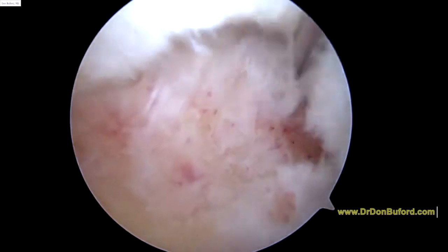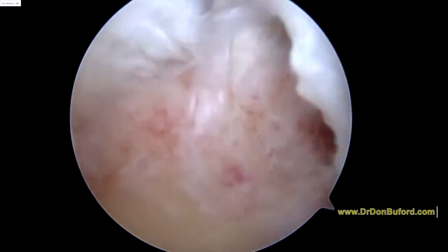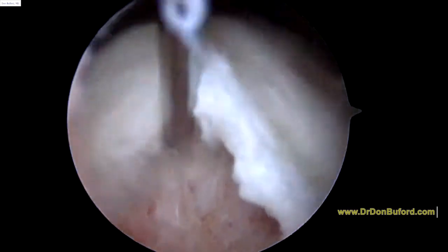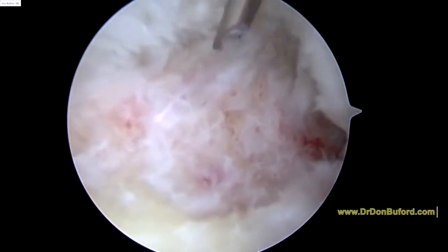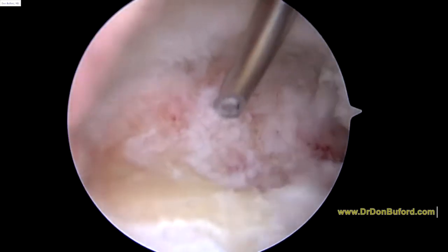Using this needle partly as a probe, but also just to check where we're going to place our anchor, to orient ourselves in the subacromial space. I'm going to place our anchor down right about here.